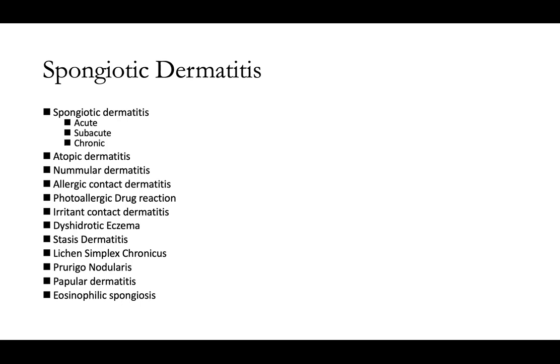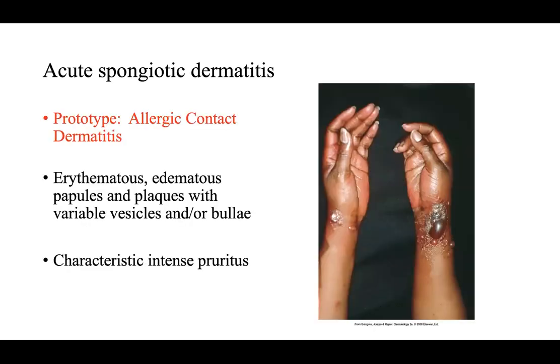And so being able to say specifically what the diagnosis is when you see a spongiotic reaction pattern is going to be difficult unless you have some good clinical information, and there are some other helpful hints that can really put you more towards the accurate diagnosis. But in some cases, you really just have to sign it out as spongiotic dermatitis and describe what you're seeing, and then based on the clinical history, give them your favorites.